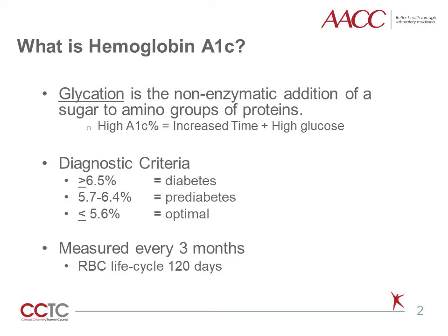Typically, a hemoglobin A1c value greater than 6.5% is diagnostic of diabetes when observed on 2 occasions. This diagnostic cutoff was established from several large studies, including a 10-year follow-up study in which hemoglobin A1c was measured at baseline, and participants were monitored for the prevalence of diabetic retinopathy, nephropathy, and neuropathy over that 10-year span. The data indicated that hemoglobin A1c value greater than 6.5% was associated with a dramatic increase in the risk to develop diabetic retinopathy in the adult population. Interestingly, these values have not been validated in the pediatric population.